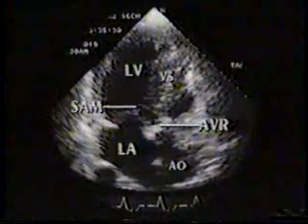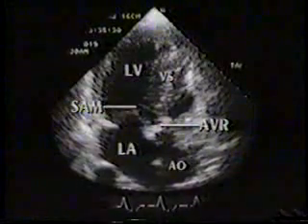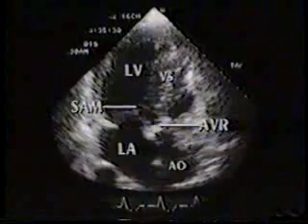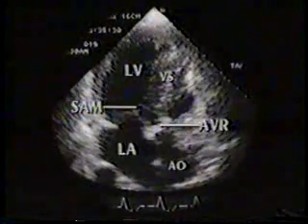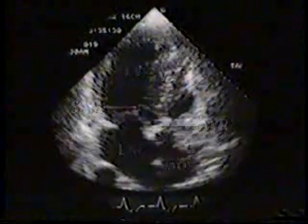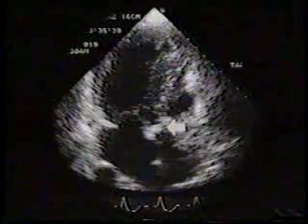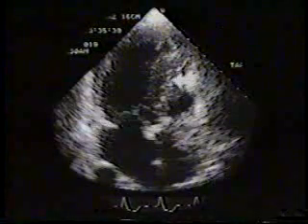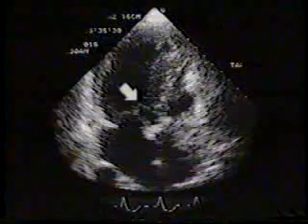Patients with valvular aortic stenosis can develop asymmetric hypertrophy, resulting in a Venturi effect with dynamic subvalvular obstruction. This dynamic obstruction will persist after aortic valve replacement unless a myotomy-myectomy is also performed. This patient was studied while recovering from implantation of a bioprosthetic aortic valve. The septum is hypertrophied, and there is systolic anterior mitral motion.